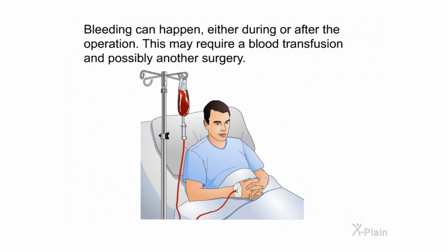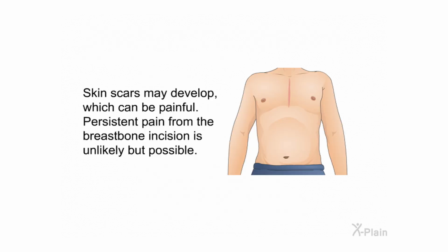Bleeding can happen either during or after the operation. This may require a blood transfusion and possibly another surgery. Skin scars may develop, which can be painful. Persistent pain from the breastbone incision is unlikely but possible.